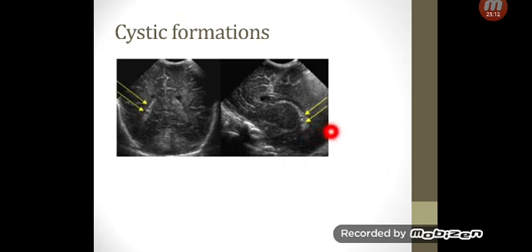Okay, so going to the next point in your screening test, which is looking for cystic formations. Cysts are basically different from each other.